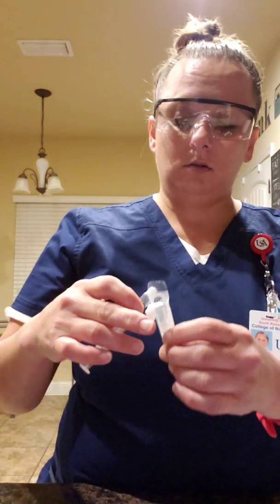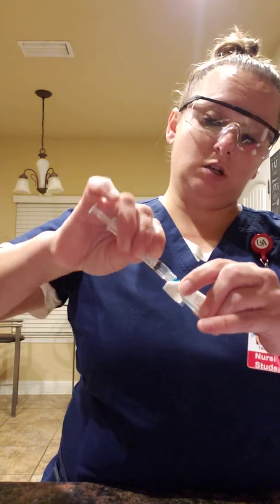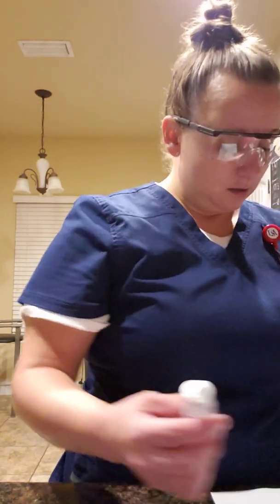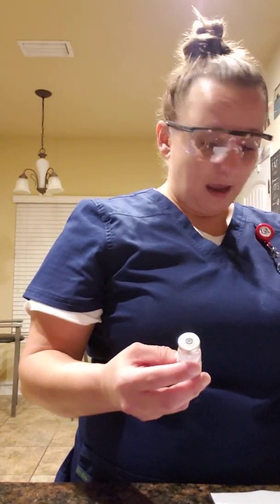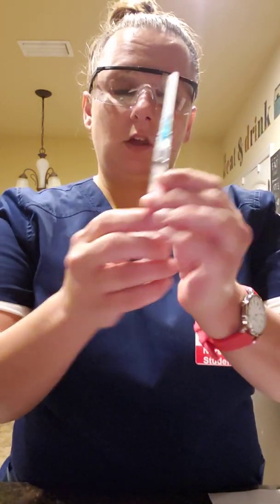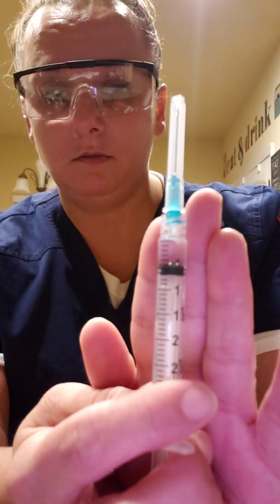Now I will put the 23 gauge needle on, and I will check again for the medication. Morphine sulfate, 5 milligrams IM every 4 hours as needed for pain. I need half a milliliter. Half a milliliter is what is in the syringe.